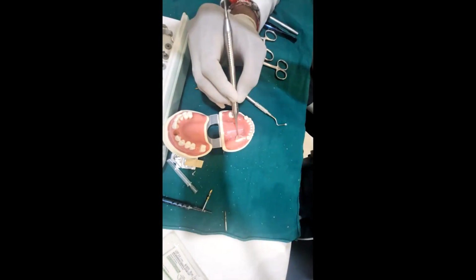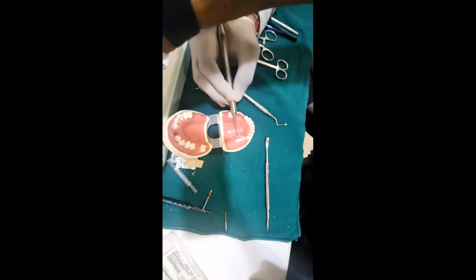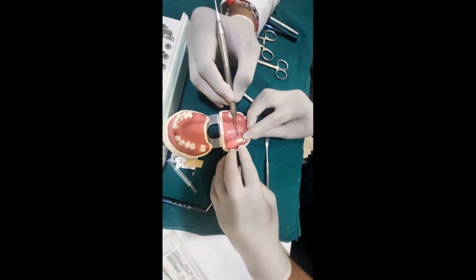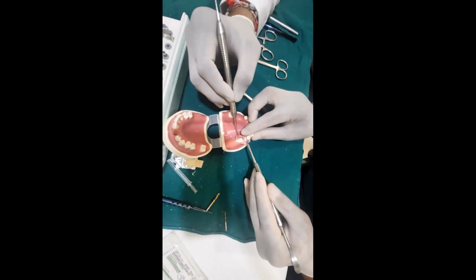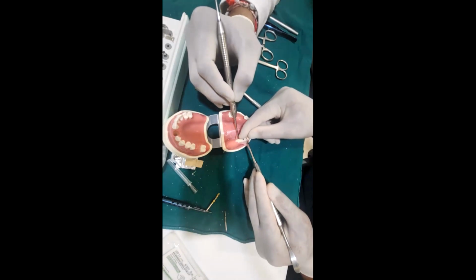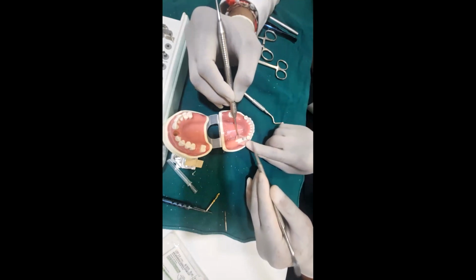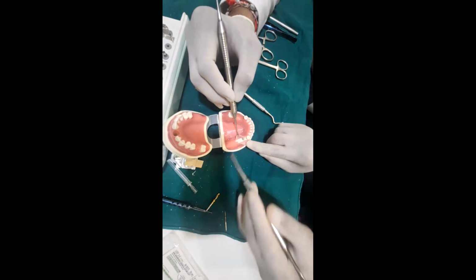The next will be your 3.5. But what you should do at this point, you are supposed to take a parallel pin and take an X-ray for the angulation and understanding the orientation of your implant, whether it is parallel to your adjacent tooth, it is not touching the root of your adjacent tooth, and the proximity to the anatomical landmark, which will be in this case the mental foramen, because we are right above it anatomically. If we are in this area, then we have to be worried about the inferior alveolar canal.